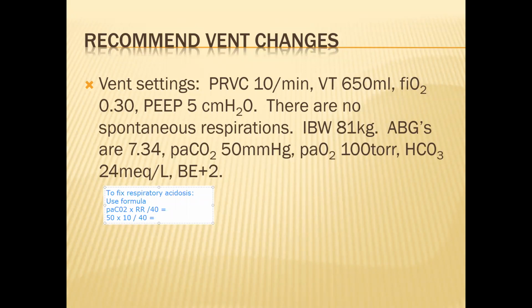So where did I come up with all those numbers? Does everybody know? Because I don't want to leave anybody in the dust. Brent, you didn't say anything. Where did the number 40 come from? 35 and 40. That's where we want our CO2. Where did the 50 come from? Yeah, I didn't want to go fast and then lose you guys.